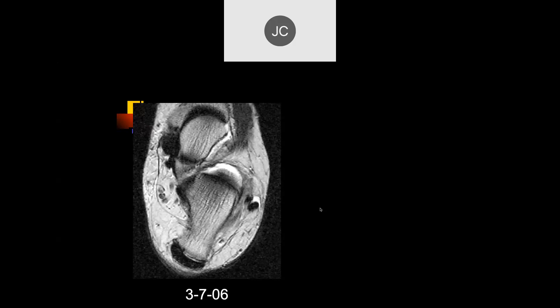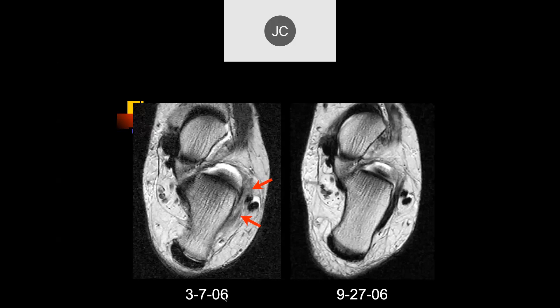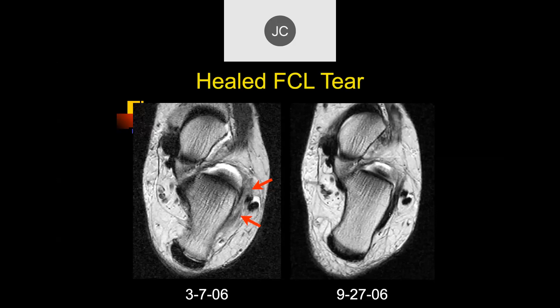Lateral to the calcaneus is where I would expect the calcaneal insertion of the fibulocalcaneal ligament. I see some indistinctness. This is on 3-7-06, and here's what it looks like six months later — it looks like it's scarred down pretty well, with that typical thickened appearance of a ligament after it's healed. So that's a healed fibulocalcaneal ligament.